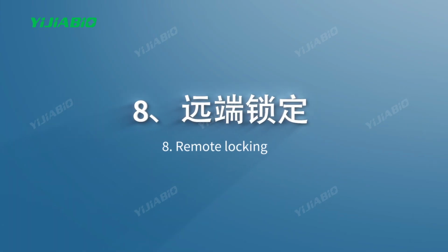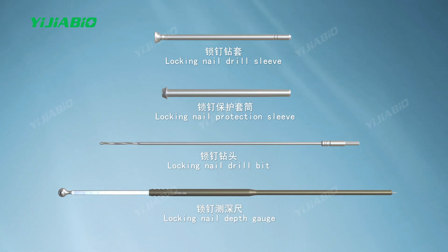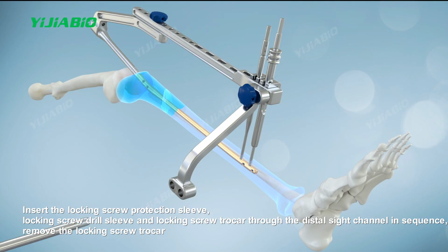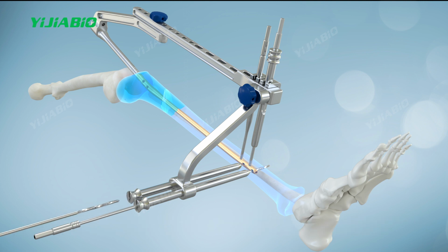Eight, remote locking. Install the distal sight and the distal guide rod on the inner side of the distal tibia and lock it with the guide rod bolt. Insert the locking screw protection sleeve, locking screw drill sleeve, and locking screw trocar through the distal sight channel in sequence. Remove the locking screw trocar and use the 4.0 locking screw drill bit to drill through the cortical bone to the opposite side. Use the same operation to complete the insertion of the other locking screw hole.